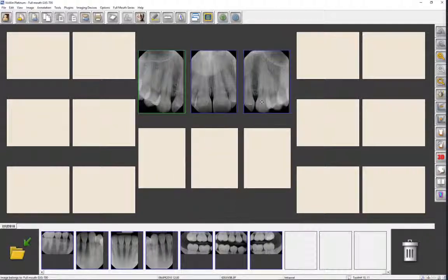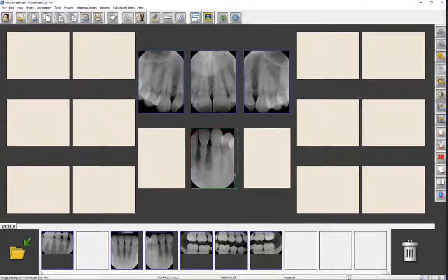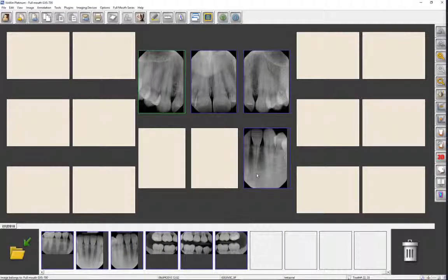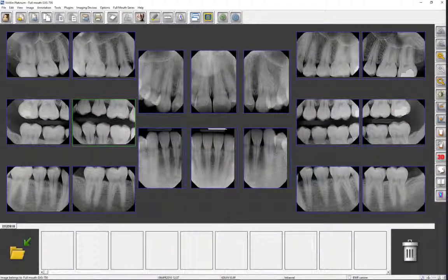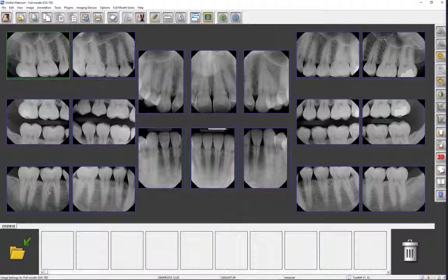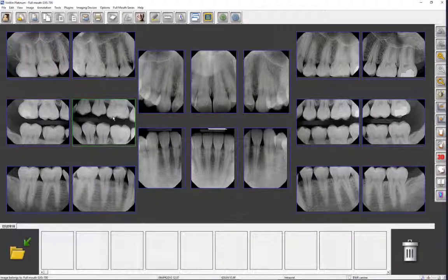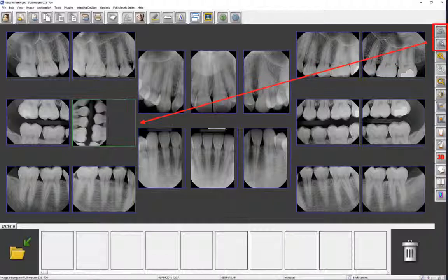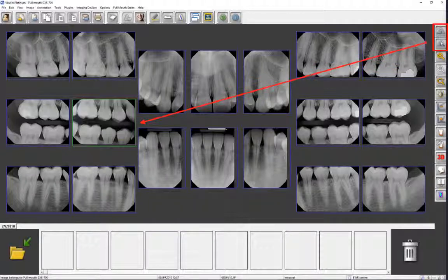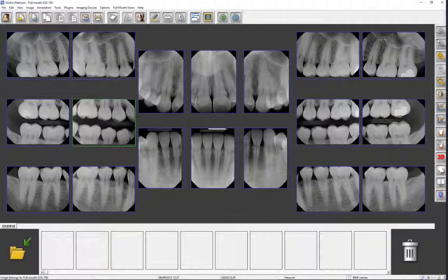Once your images are in place, you may need to edit them. When you drop an image over an existing image, they will swap positions. You may also need to rotate an image to a more preferred orientation by clicking on it and then clicking on the Rotate Left or Rotate Right icon, which are located on the sidebar. All modifications are automatically saved.